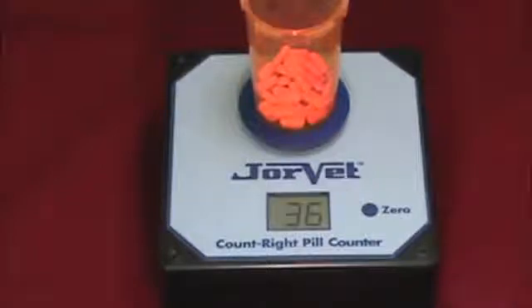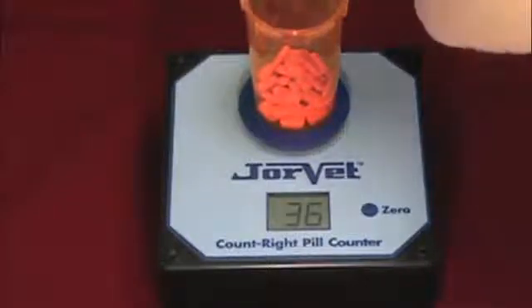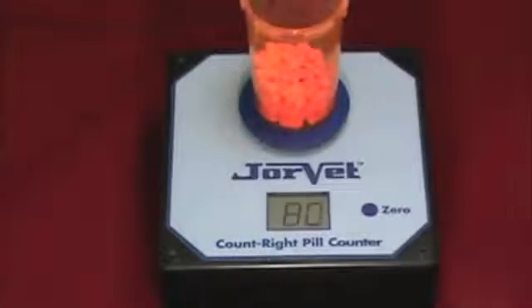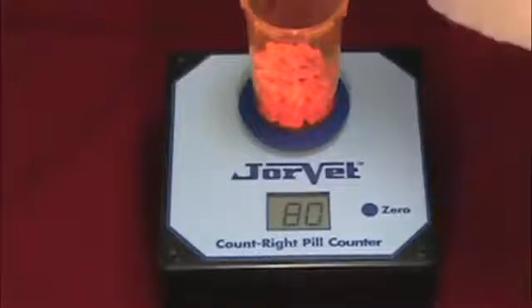Continue to add pills, pausing every ten to thirty pills to allow the counter to recalculate and display the current count. Be sure to wait for the display to stop blinking before adding more.